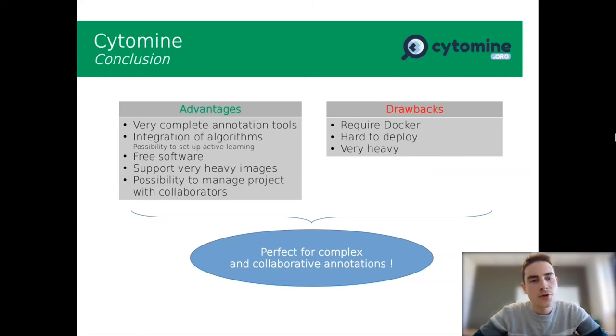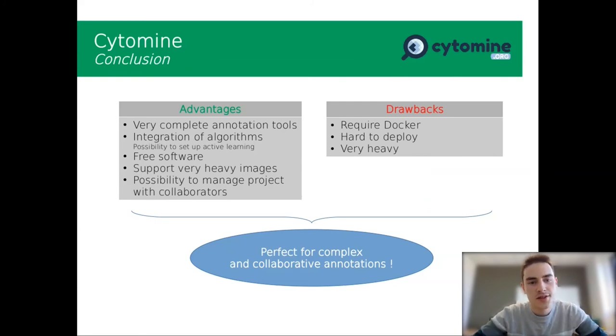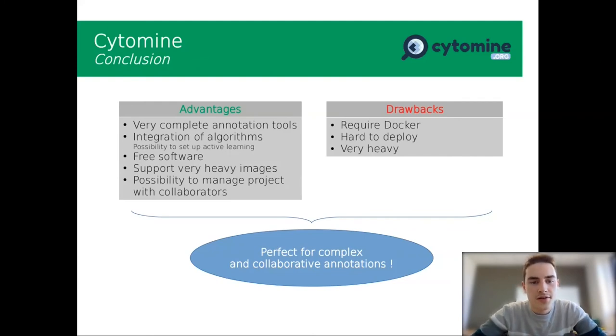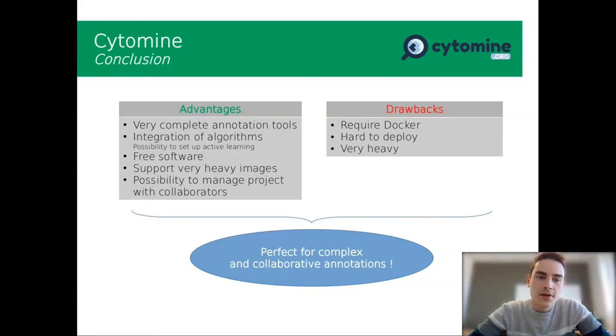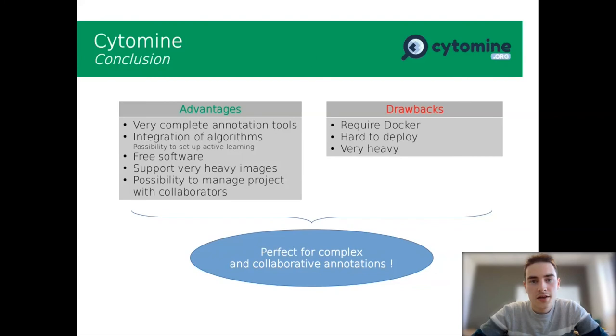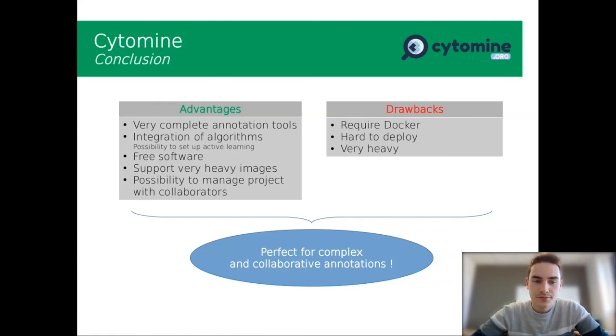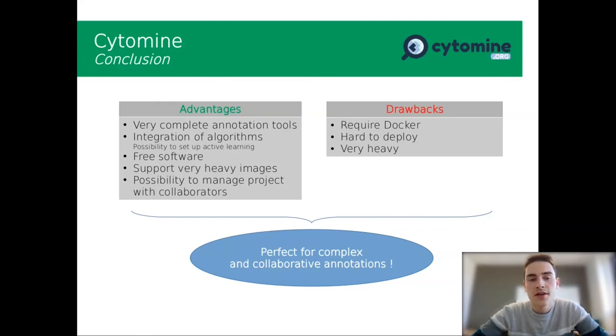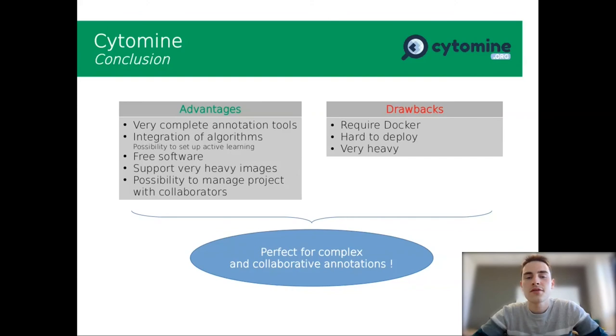So to conclude on Cytomine, I think there are many advantages. It is a very complete annotation tool. You can integrate all the algorithms you want and you can set up active learning on your images. It is also free software and you can use it for very heavy images. You also have the possibility to manage projects with collaborators because you can deploy it as a server.